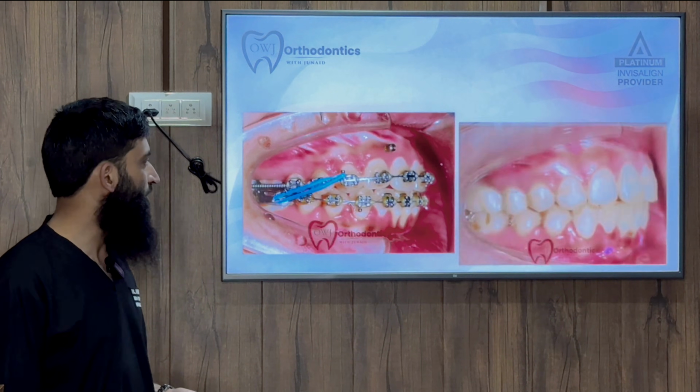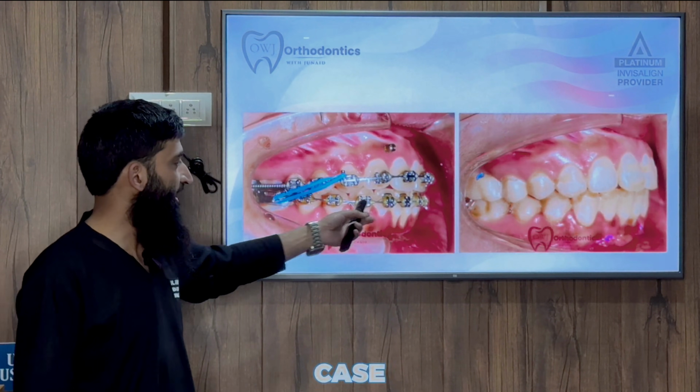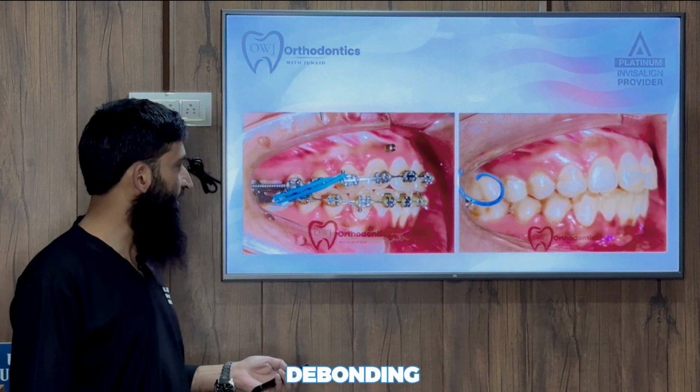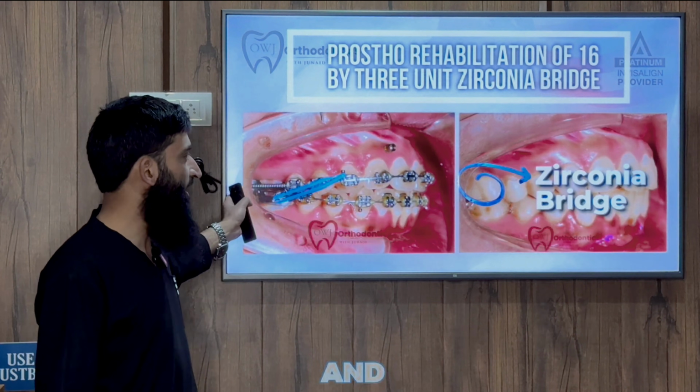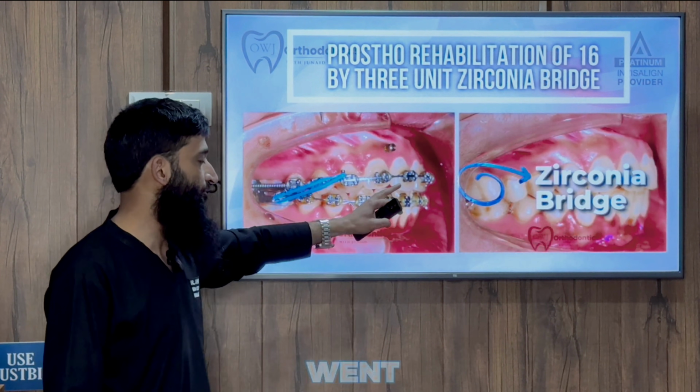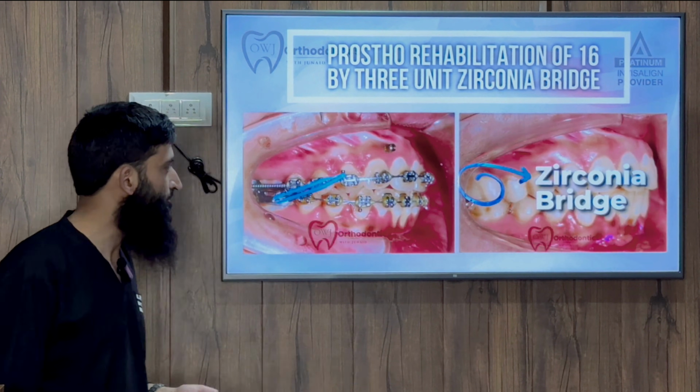So later on, this is the case after removing the brackets, after debonding, and we restored, and the patient finally was not ready for the implant, so we went for the zirconia bridge.